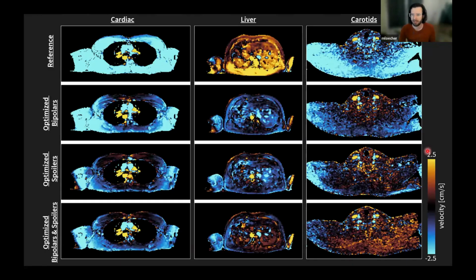And then if we zoom in to the background velocity, you can see the uncorrected here. These start getting a little bit noisier, but maybe, and I'll show you the actual measurements later. But here you can see the background velocities and how that's getting smaller, with the 3 different optimized methods.